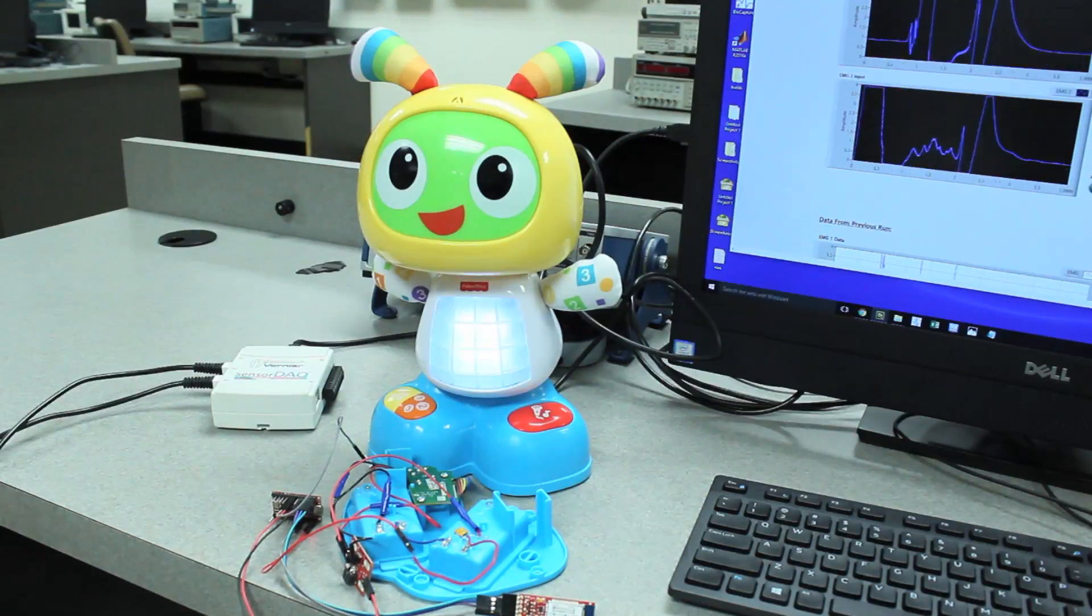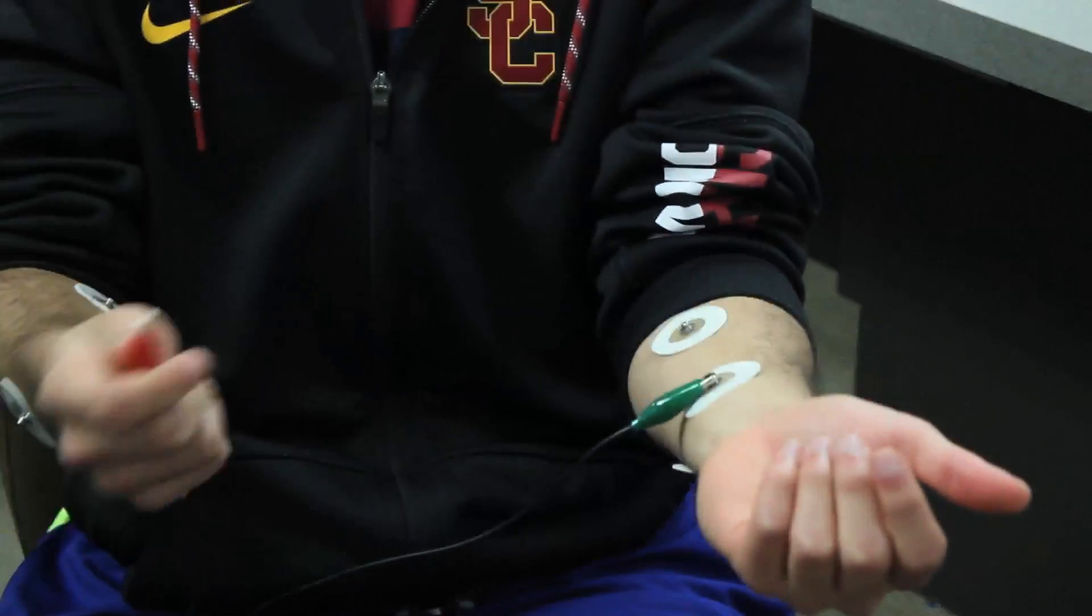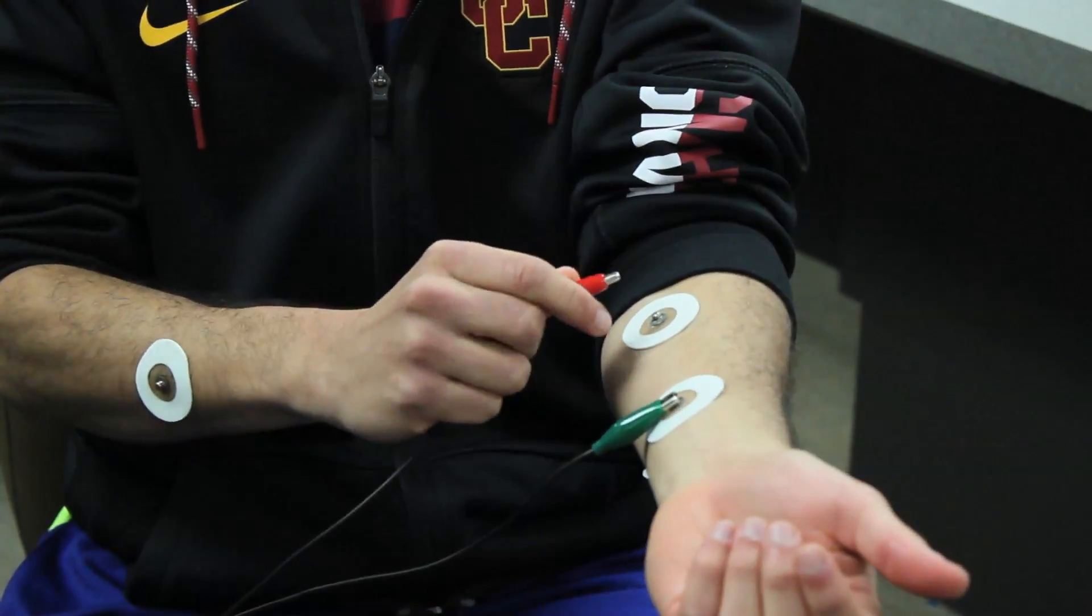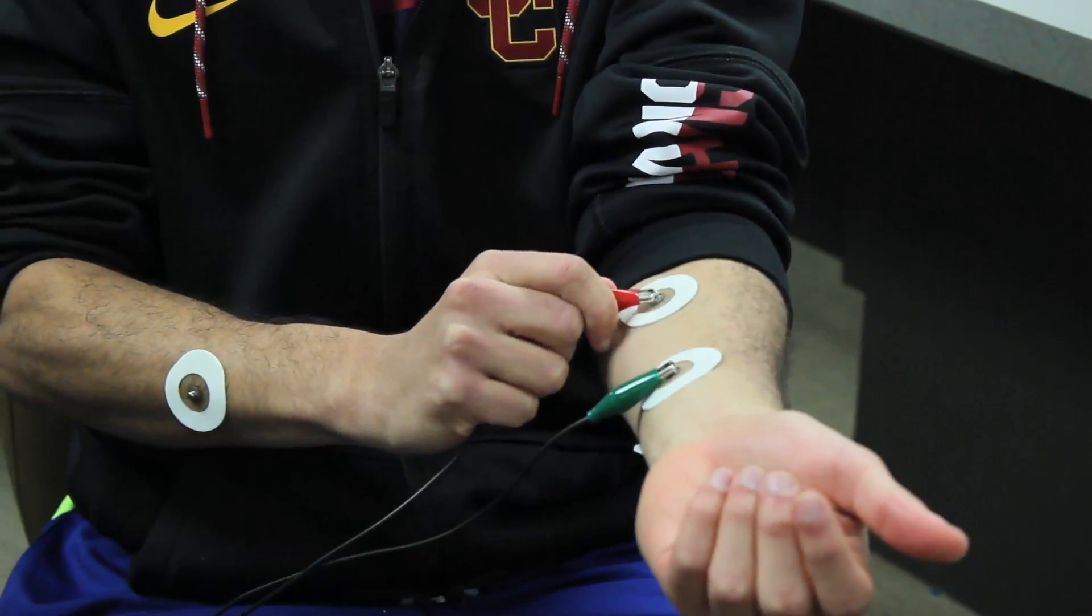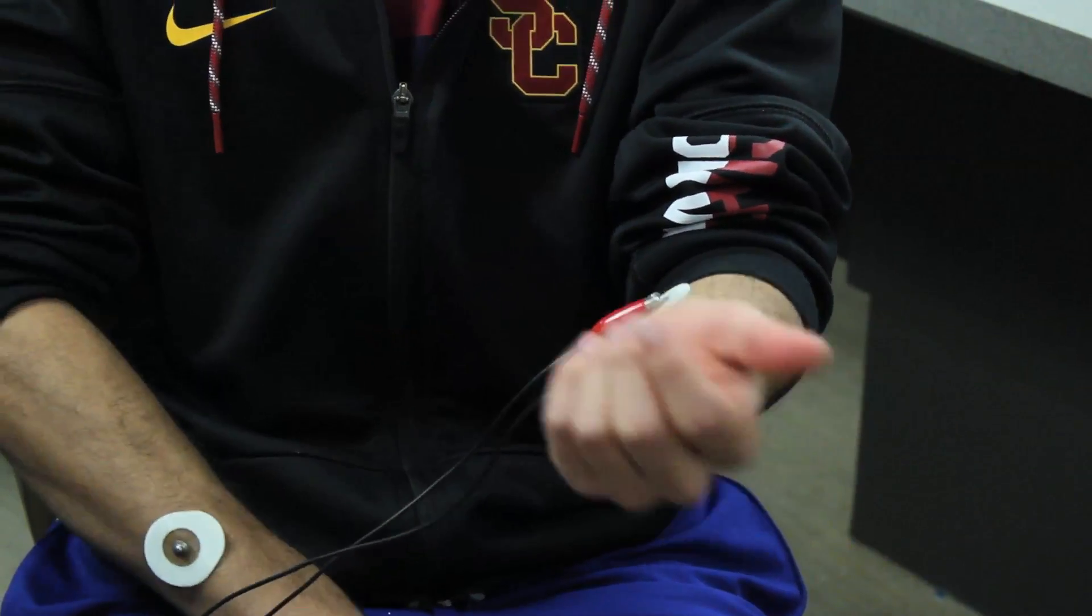The target users for the system are the parents and physicians related to these infants who have this condition. To use this system, connect the EMG sensors to the target muscles. These sensors will send a signal to the computer through the sensor deck.